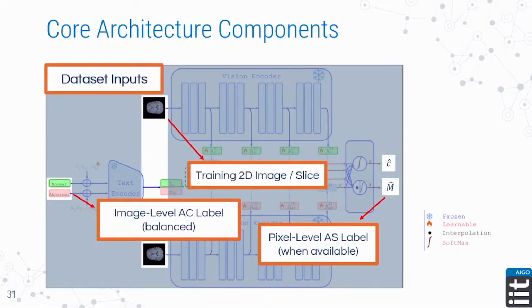We have this branch on the top is for normal. The other branch here is for abnormal. This is a ViT architecture. There are 24 layers. So we take the output of these layers at a certain point. We just subdivide the 24 layers of ViT in 4. So we have these 4 outputs from the vision, normal, abnormal.